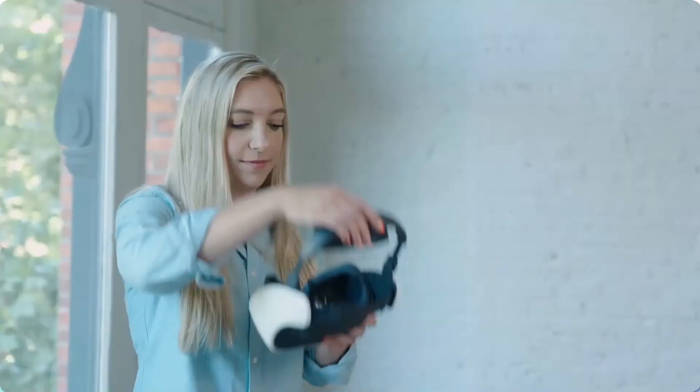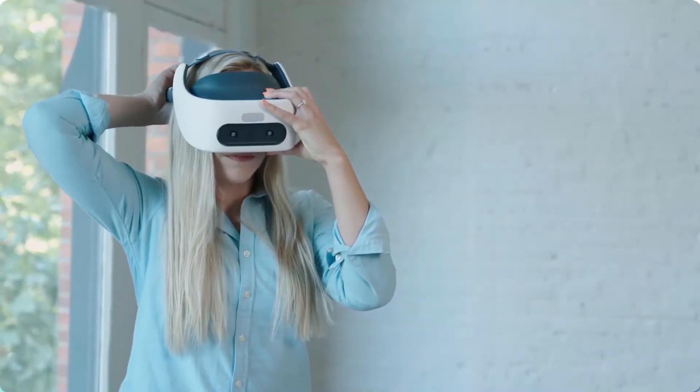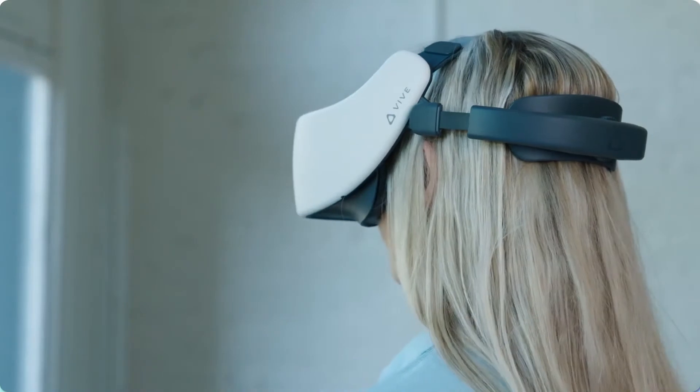In this video, you will learn how to set up the Vive Focus Plus headset and get started with the XRHealth virtual reality applications.